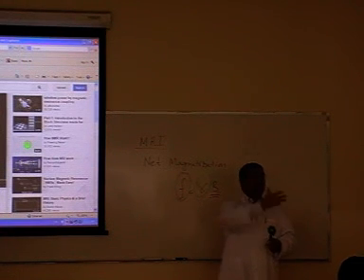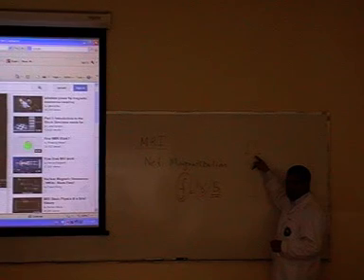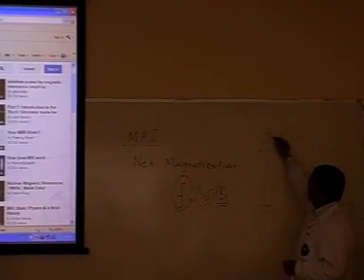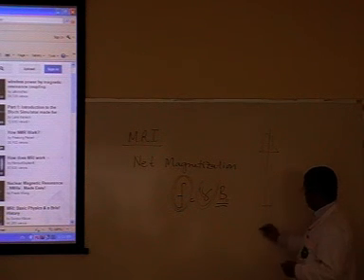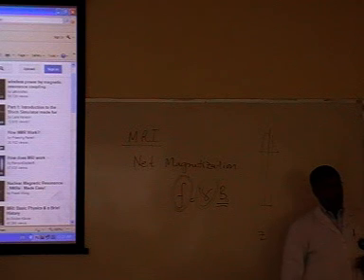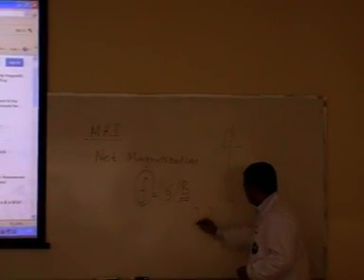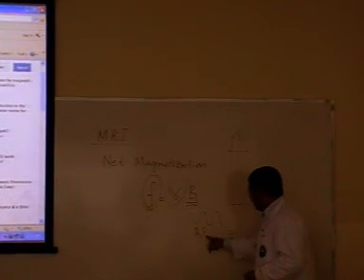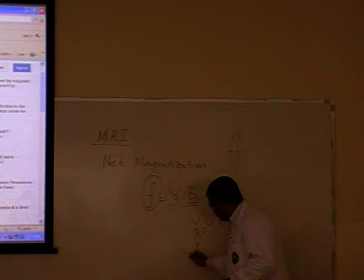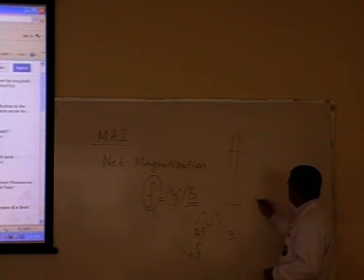This way, the energy will be transferred to the protons, and they go from their, let's say, equilibrium state into an excited state. So they go from this, let's say the Z, we call this the Z, where we're taking the Z as the long axis of the patient. Once you apply an RF frequency, an RF EM wave at the same frequency as this one, the protons will gain energy and go to the excited state.